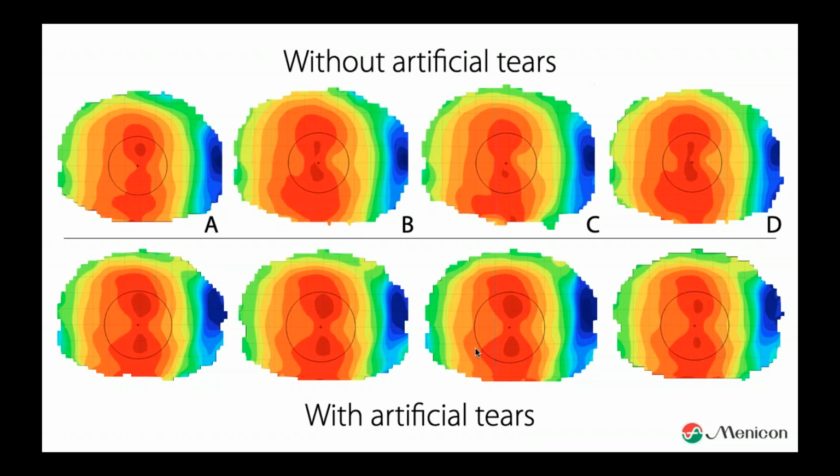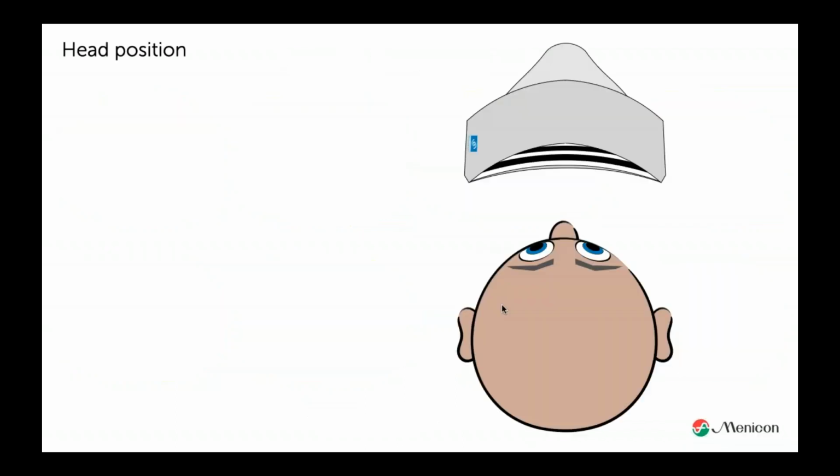Yeah. So again, that was the answer. If I measure four measurements and one is off, I go on with the other three. But if there's already 50% off, I have a tear film problem. Just first solve that and do the measurement again. Okay. Then, what I already mentioned, head position, quite important.